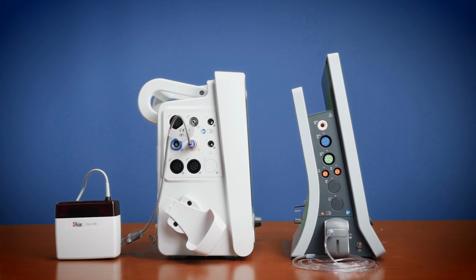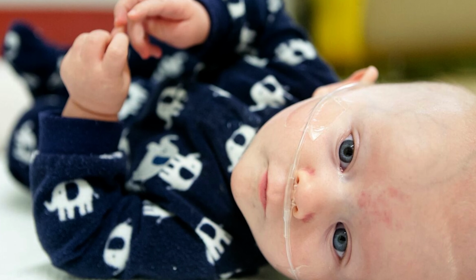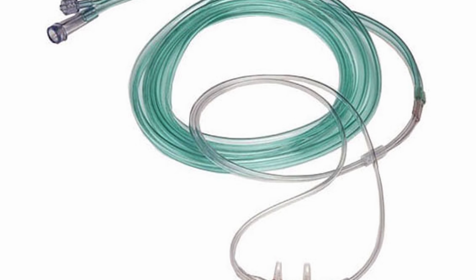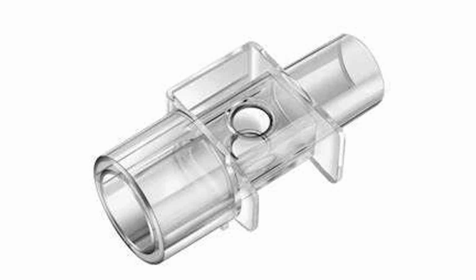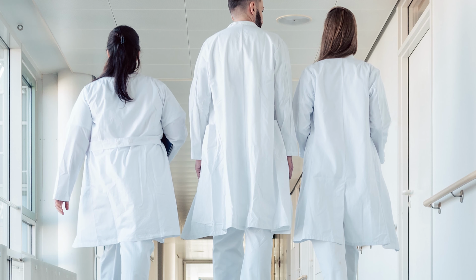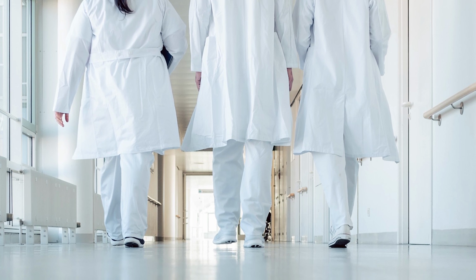Regardless of the type of module being used, the disposables will depend on the patient and procedure. There are adult sizes, pediatric, and neonate sizes. If a patient needs O2 administered, there are divided cannulas. If a patient is intubated, they will need an endotracheal tube. There are also T airway adapters to measure side stream while a patient is being intubated. So based upon your facility and their procedures will depend which accessories they will need.